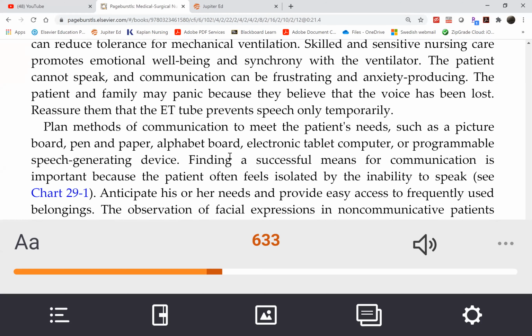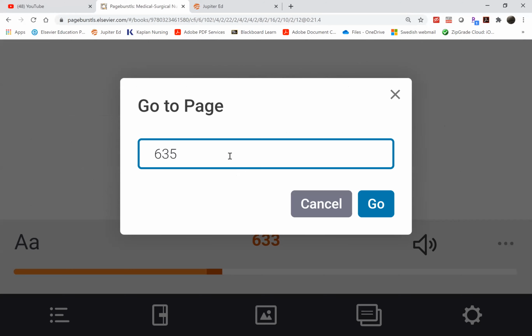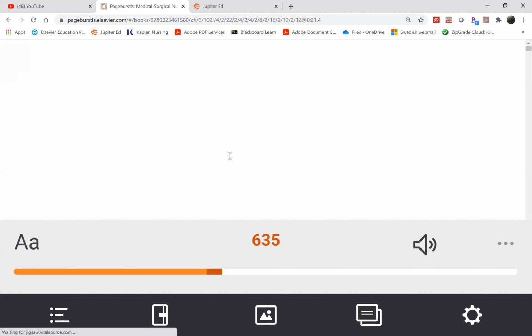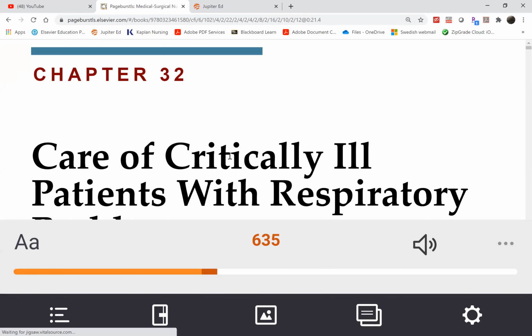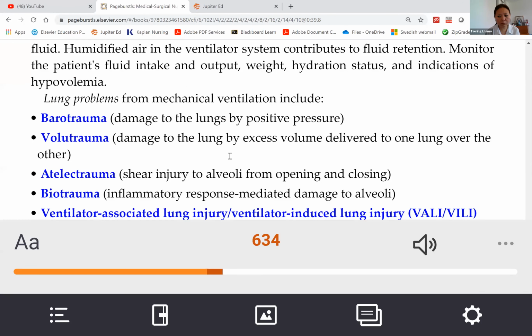In pressure support, this is a pressure mode. There is no preset tidal volume, there is no preset rate. The only thing preset here is pressure. Now, is pressure a breath? If a ventilator gives pressure, is it giving a breath? Yes.